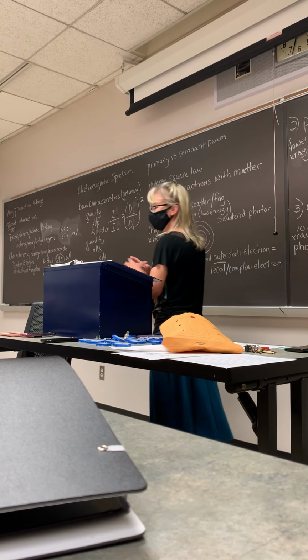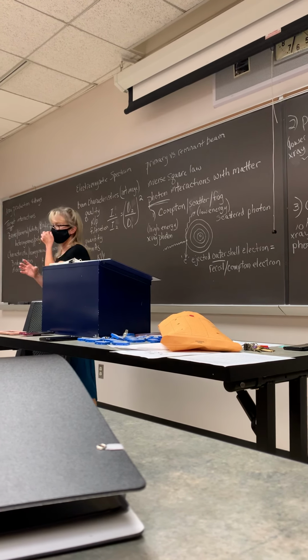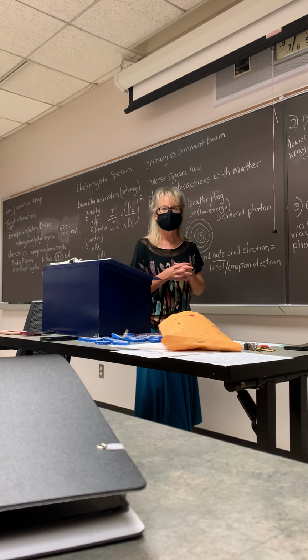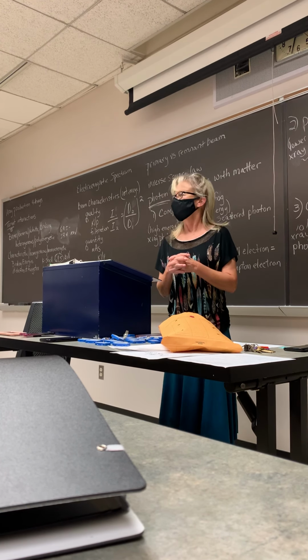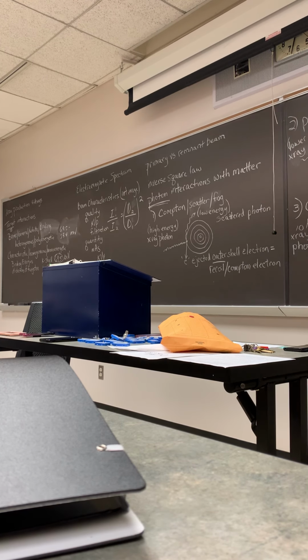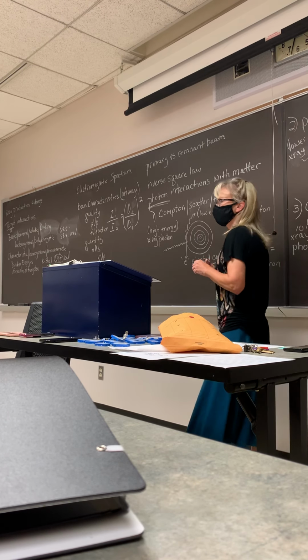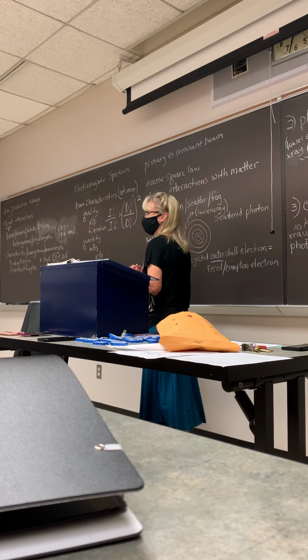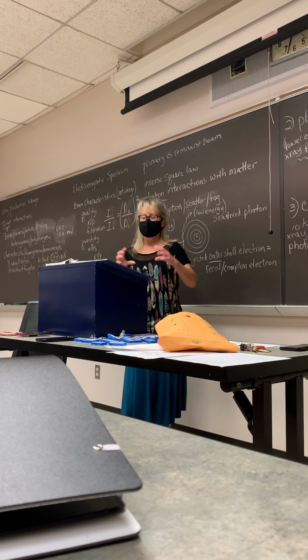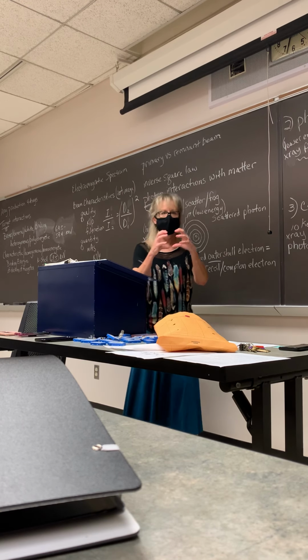Focusing cup. Okay, so we need to keep them together for a little bit. So the focusing cup keeps them together. What's the focusing cup made out of? Good, molybdenum, however you want to say it. Sometimes nickel. What's the focusing cup given? What kind of charge? Negative. Good, the focusing cup is given a negative charge, and that's what keeps those electrons in a little cloud.